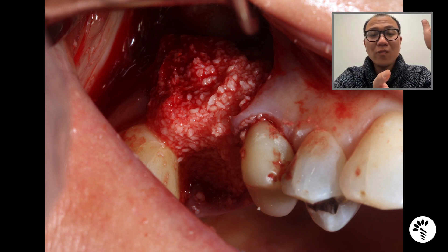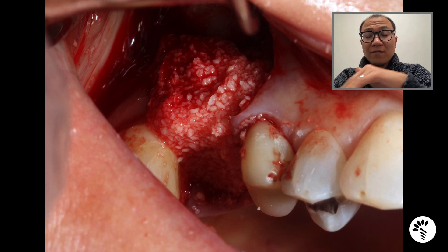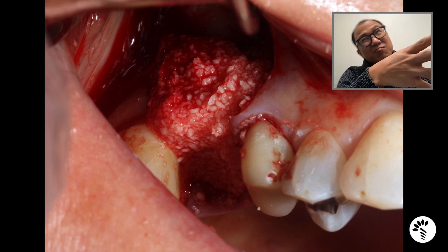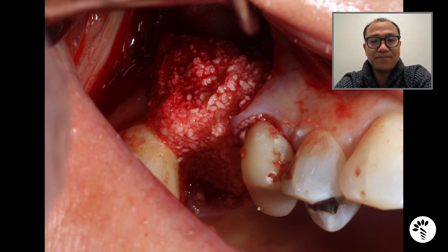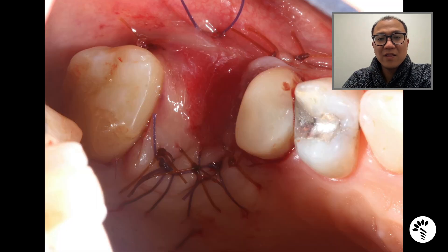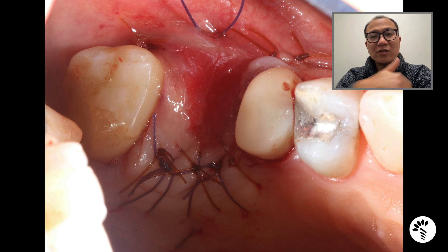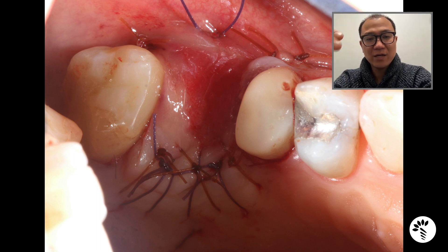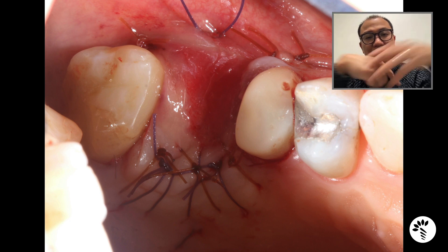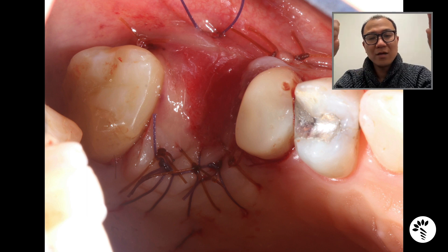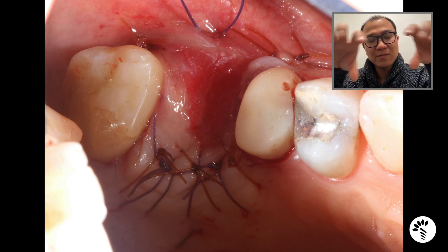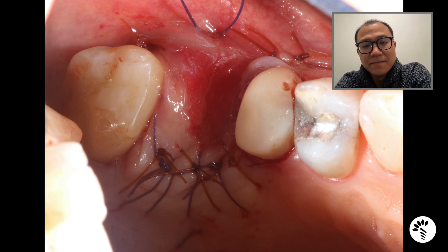There's no reason to be confined by the socket width — I would love to increase it further. You can see I added more bone buccal to the socket. This is where the buccal wall socket graft turns into more of a ridge augmentation. After that, I place a membrane tucked from the buccal aspect to the palatal, then achieve primary closure by advancing the flap. I place horizontal mattress sutures from the buccal to the palatal to bring the released flap coronally, followed by a series of sutures — a continuous suture using 4-0 Vicryl and 5-0 and 3-0 chromic gut sutures on the crestal aspect — to maintain primary closure.